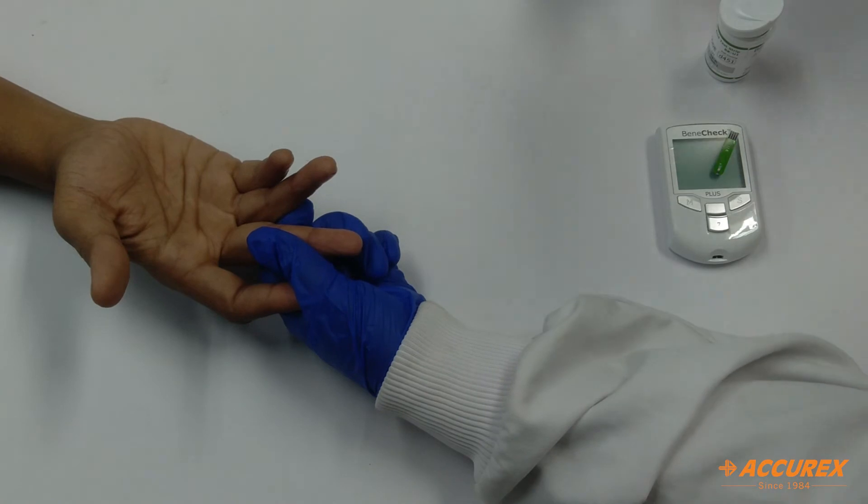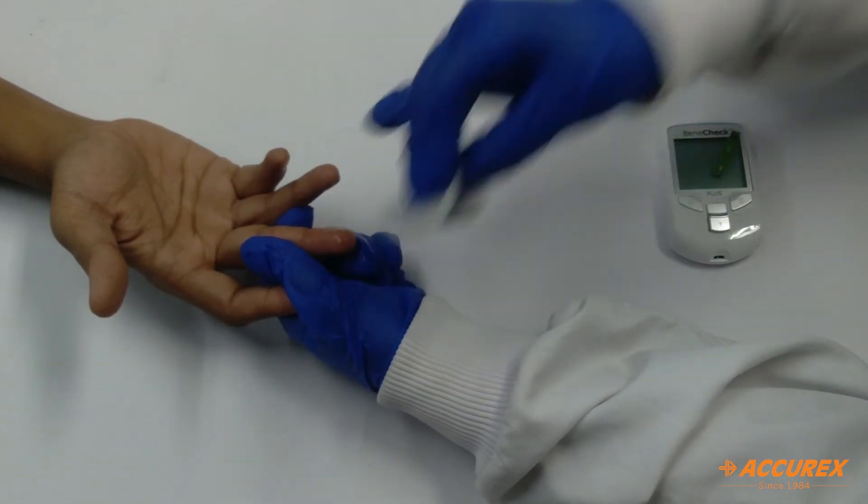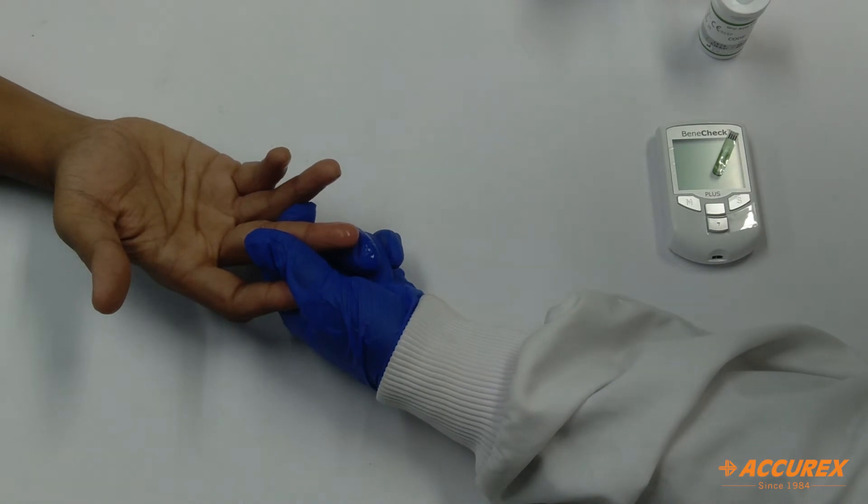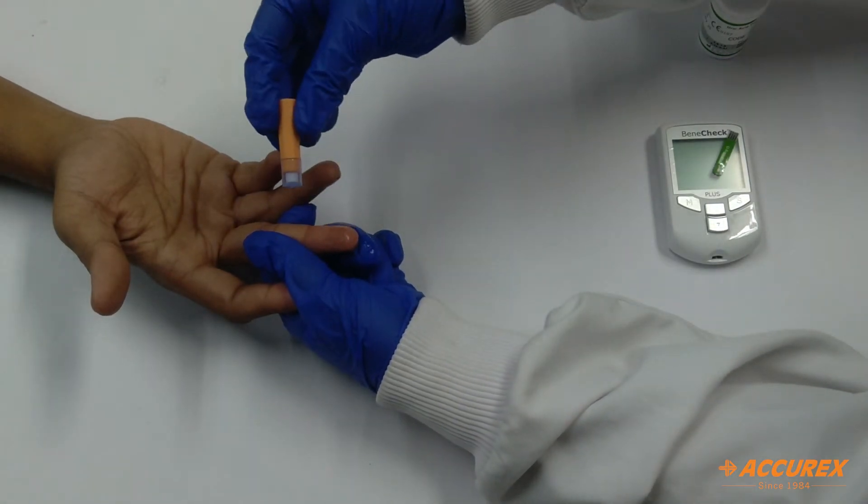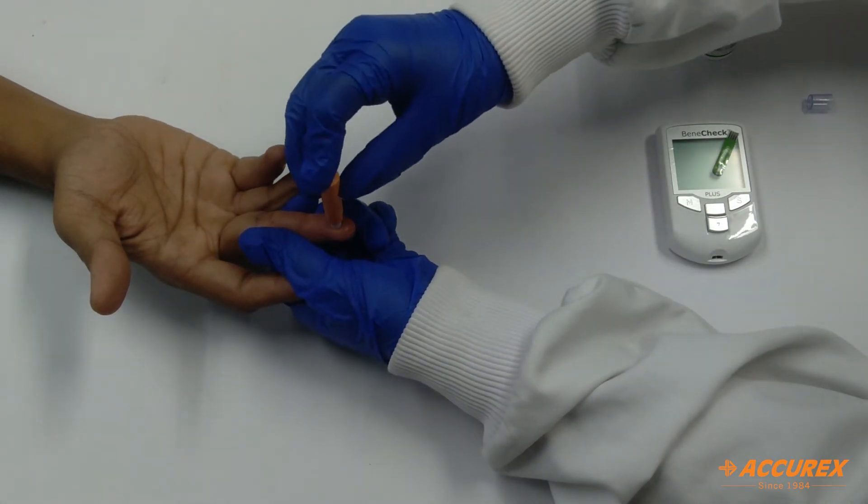Now we will first sanitize the finger and then we will take this lancet and we will just prick on the finger.